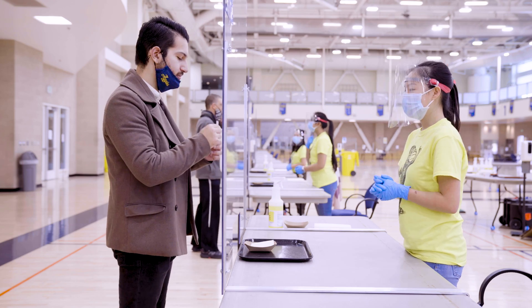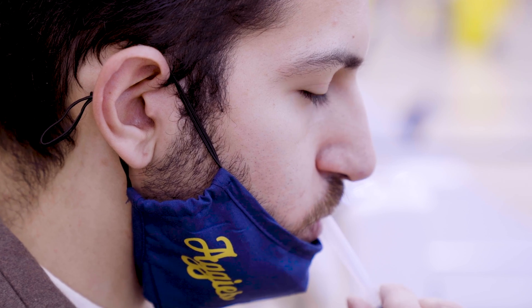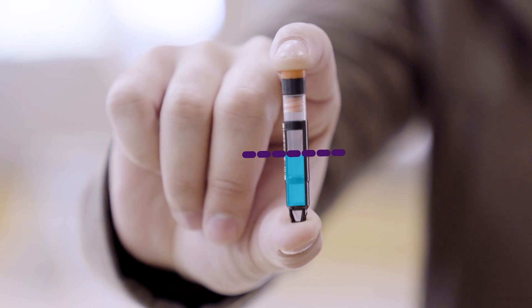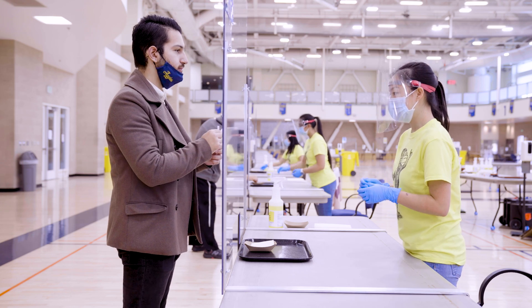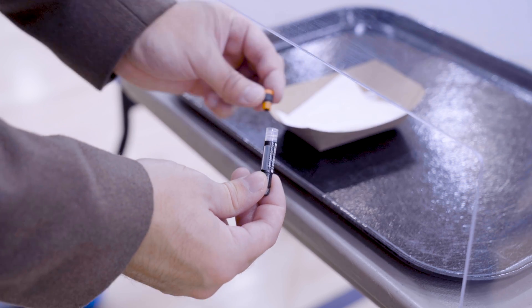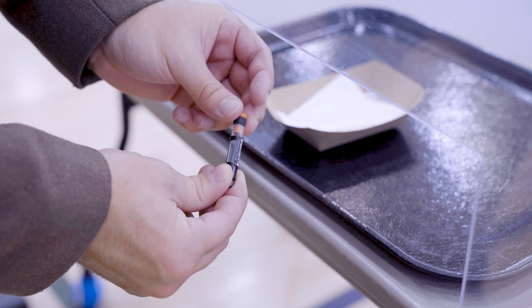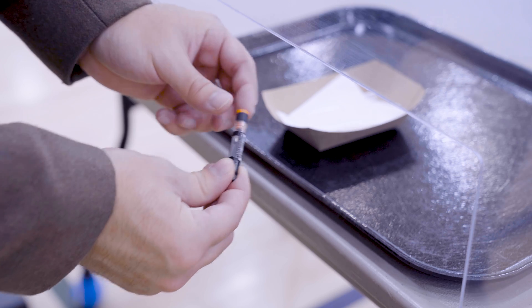Place your lips on the straw and push saliva through the straw into the vial. After filling the vial a little more than halfway, remove the straw and place it into the container. Don't fill the vial to the top. Gently twist the cap back on the vial — not too tight though — and place it in the container.